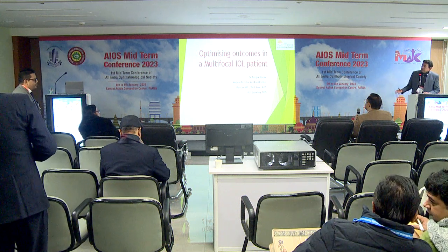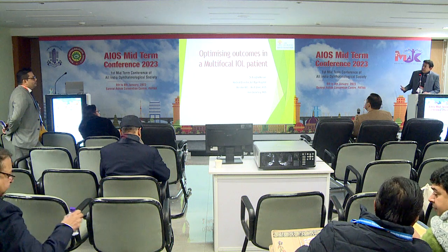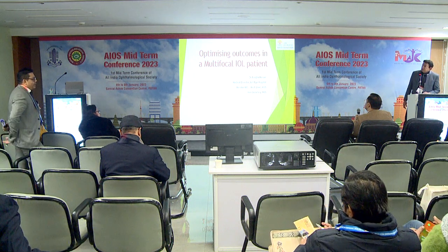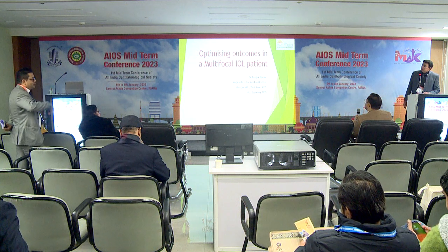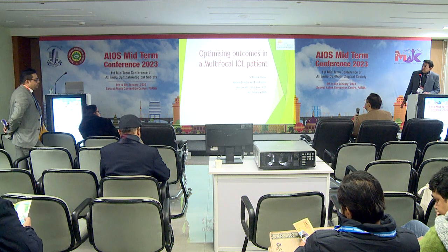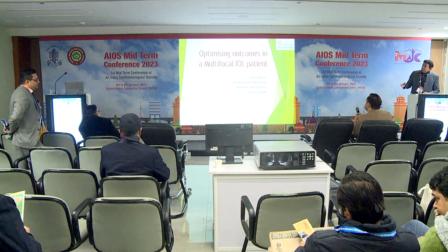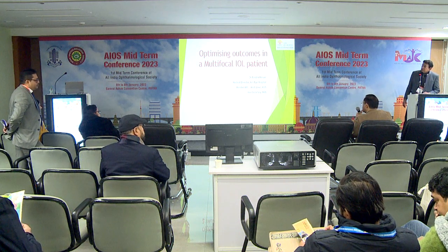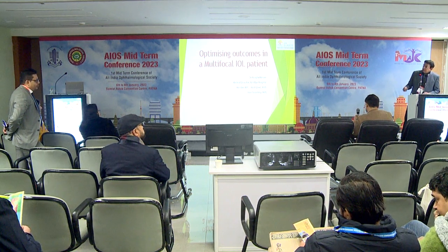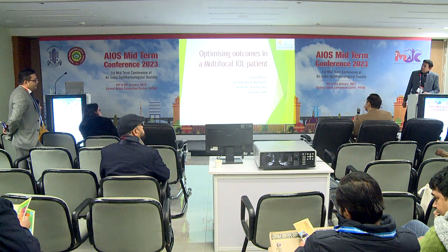The only caveat is that you have to be conscious of the fact that the lens will remain in the place you left it during the lifetime of the patient. If the bag is torn also, you can place it exactly in the bag. Exactly. I would obviously like to do only an in-the-bag implantation of a toric intraocular lens, though occasionally we have even captured the intraocular lens in the rhexis margin and tried to stabilize the lens.